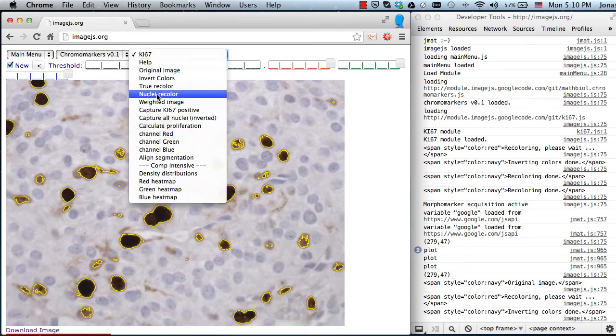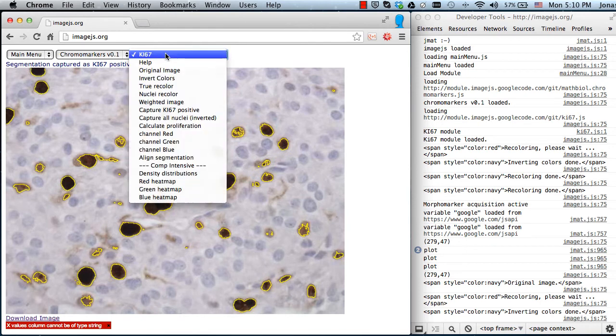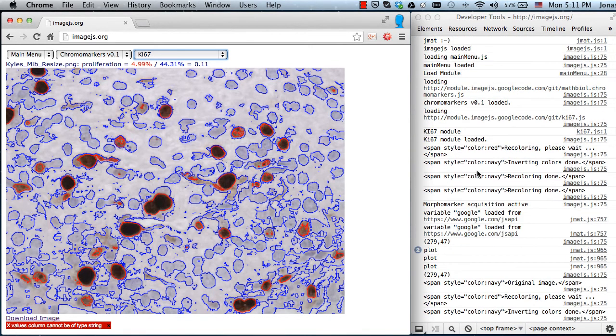We now capture only the KI67 positive. So whereas before we were capturing all nuclei inverted, meaning all that is not nuclei, now here I'm capturing only the KI67 labeled nuclei, and we should be able to calculate proliferation now. That's it, around 0.11. And you see here as we went along, I don't see any errors, so everything seems to be okay. Alright, oh no, there's a little error here, so we have to take care of this one.